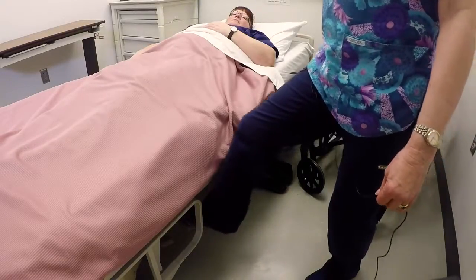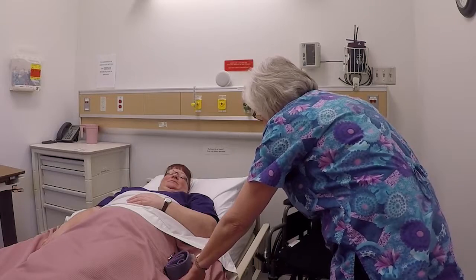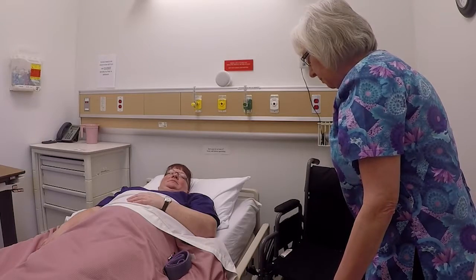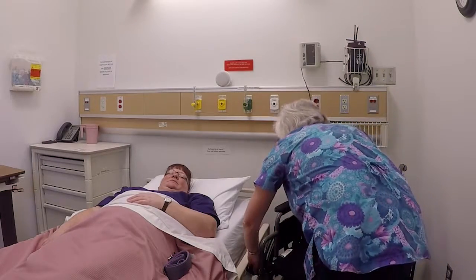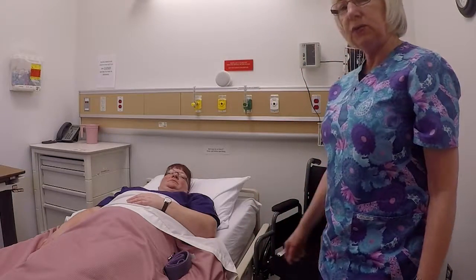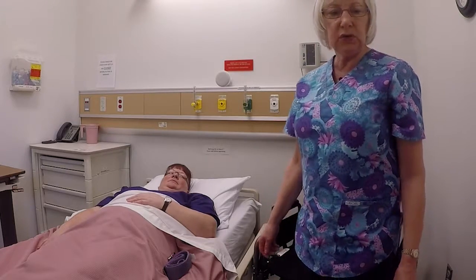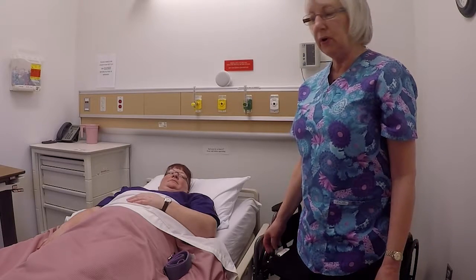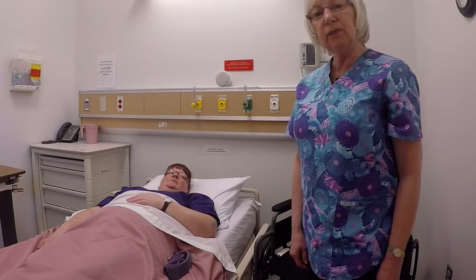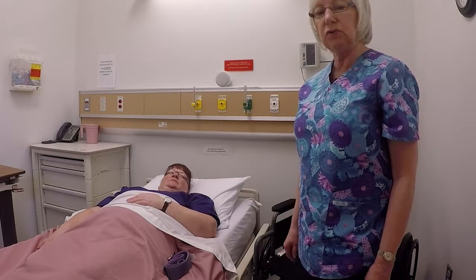Be sure and lock the bed brakes. After locking the bed brakes, I want to make sure that the height of the bed is the same height as the seat of the wheelchair. I also position the wheelchair next to the bed, locking the brakes. It's almost touching the bed. She also has non-skid footwear that I will put on her. And we want to make sure that the position of the wheelchair is next to the client's strong side. She's right-sided weakness, so when she comes in a sitting position, the wheelchair will be on her strong side.